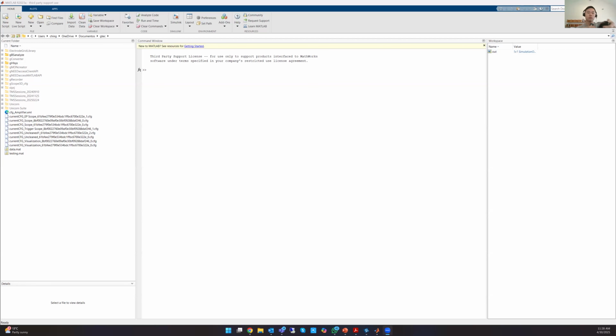Then underneath it, the electrode type is called G-Sahara hybrid. It's a pin-like structure. You can use it as dry electrodes, or if the signals are not stable, let's say you're wearing the cap running around doing different types of motion or a lot of hand movement, then in those cases, we actually recommend adding some gel to make the signal more stable.